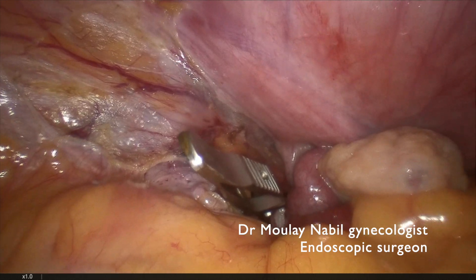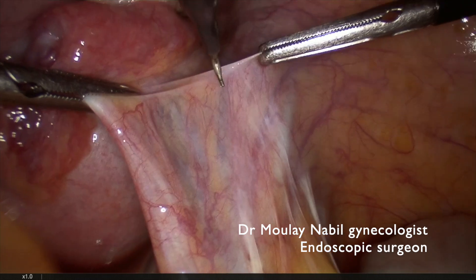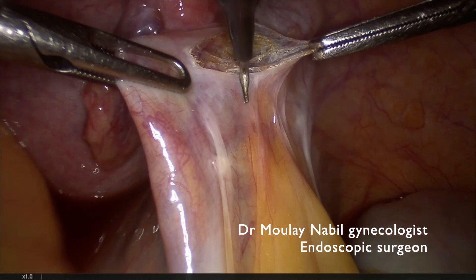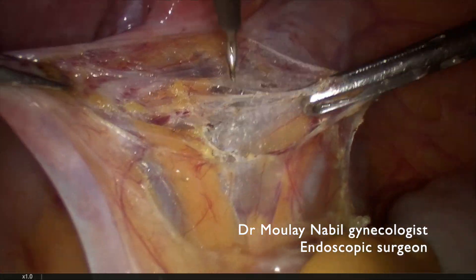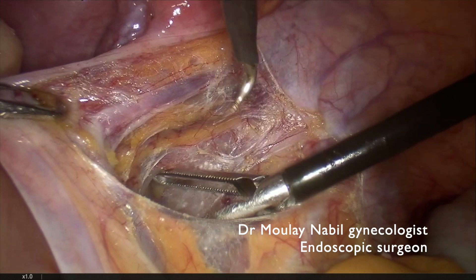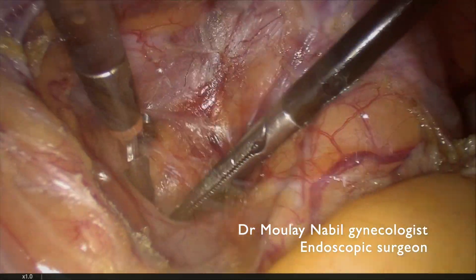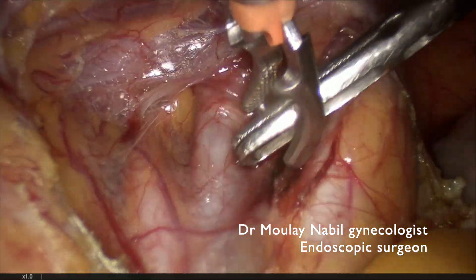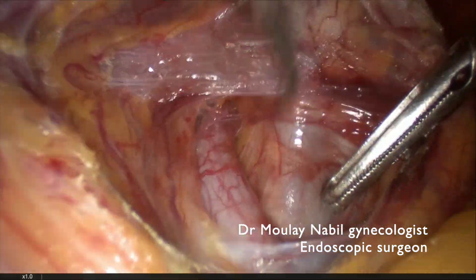We put a bulldog on the internal iliac artery, the left one, and we will do the same on the right side. We open the peritoneum lateral to the hypogastric artery. We open the retroperitoneal space and we reach our classical landmarks, which are the ureter medially and the internal iliac artery laterally.